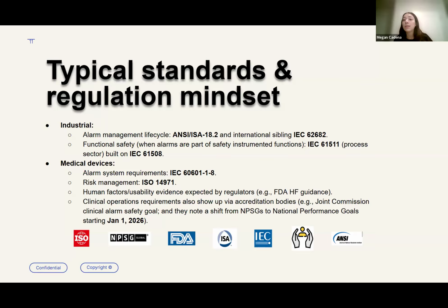If you don't design something for the right user, then you might have verified it to the correct standards, but it doesn't meet the intended need and it won't address the issues in the field. So this can look like multiple things, but essentially it's important that in, let's say, an ICU or critical care setting, they're able to manage multiple machines simultaneously.